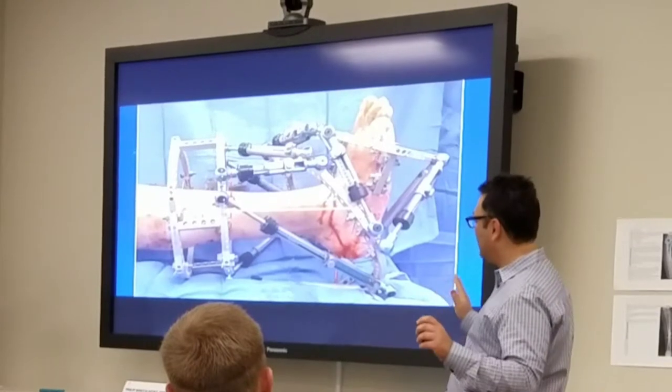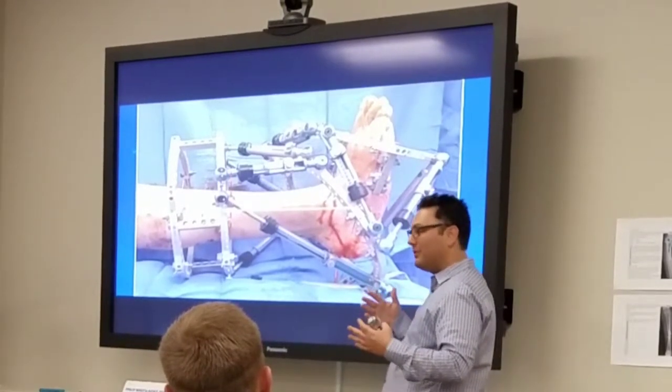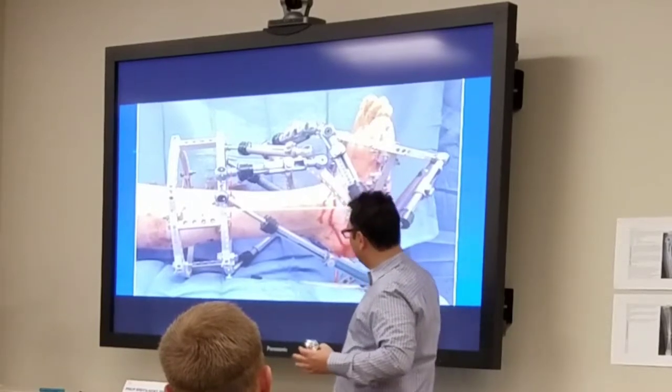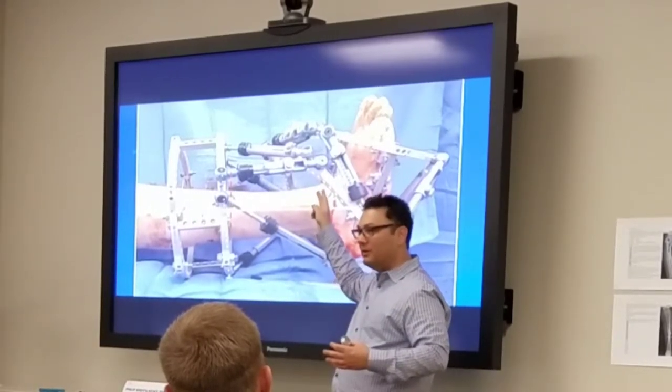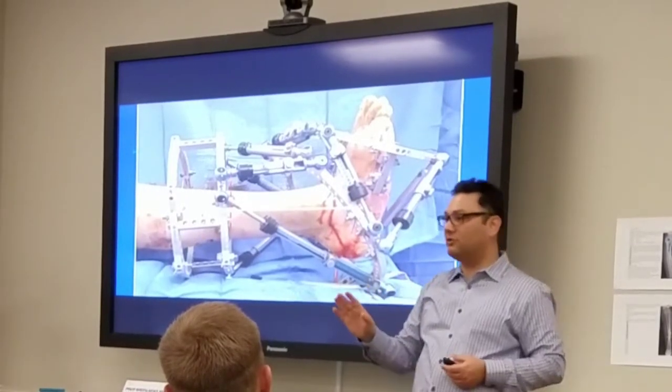It's going to be just like your equinus correction. However, when you put in your strut amounts, the computer's going to recognize that this is tilted at 45 degrees. So don't worry that this is tilted at 45 degrees. The computer knows that once you put in the strut amounts.